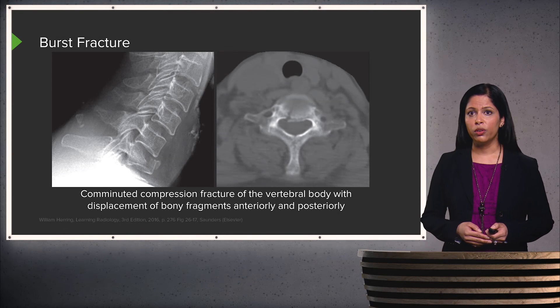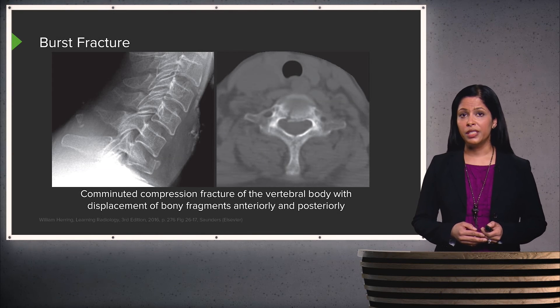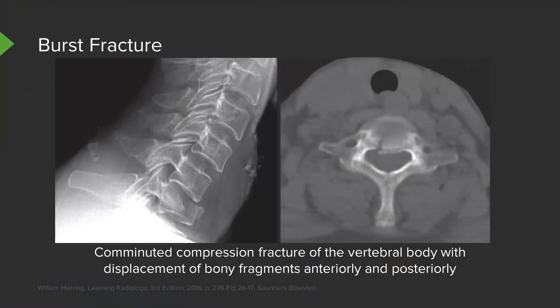Here is an example of a radiograph and a CT scan demonstrating a burst fracture. You can see a comminuted compression fracture of the vertebral body with displacement of bony fragments posteriorly into the spinal canal. Looking at the posterior vertebral line, at the level of the fracture it's displaced posteriorly, indicating posterior retropulsion of fragments. On the CT scan, the fragment is clearly pushed posteriorly into the spinal canal.